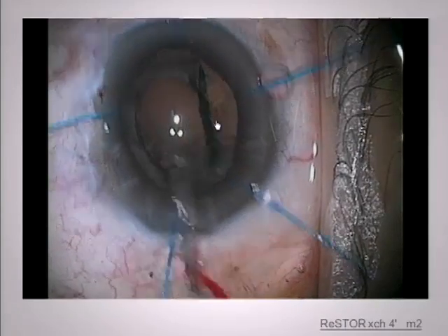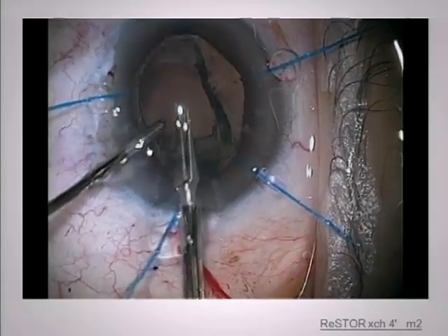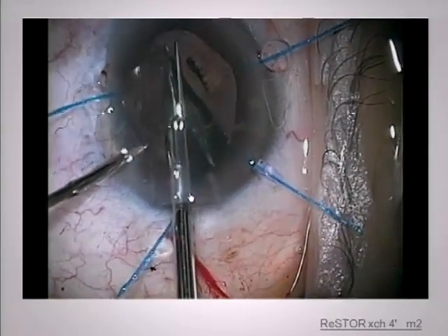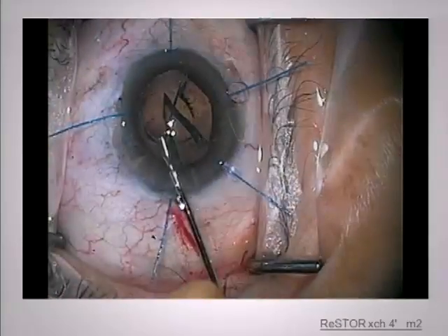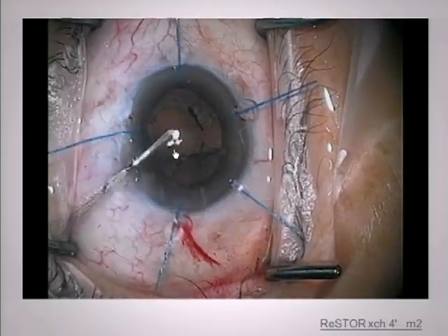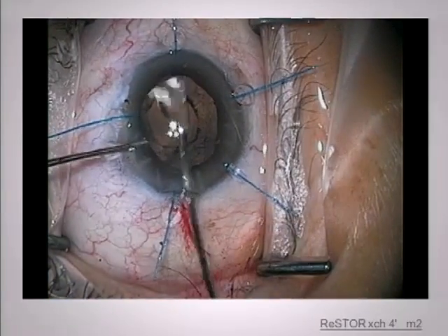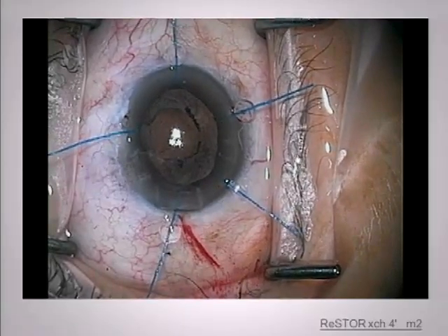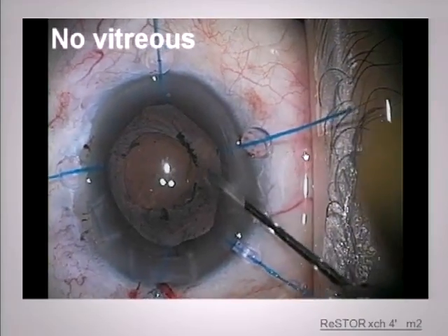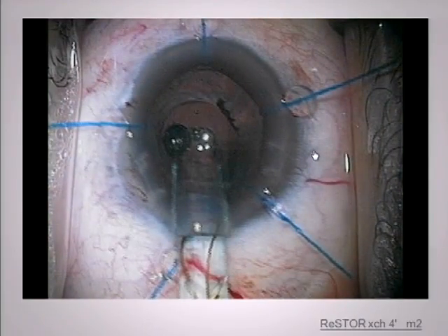This is soft enough acrylic — you could probably pull it through, but I'm going to cut this one more time. This is the typical configuration: you come in through a side port, you have bimanual fixation. You see how the sawing action of the scissors does not empty the chamber by burping it. I'm trying to put as little force on the eye as possible, knowing that the capsule is open. Would you use Kenalog here? I'm actually just sweeping, and I think there's no vitreous. That's another advantage of viscote — it really stays where you put it and doesn't aspirate out as easily.